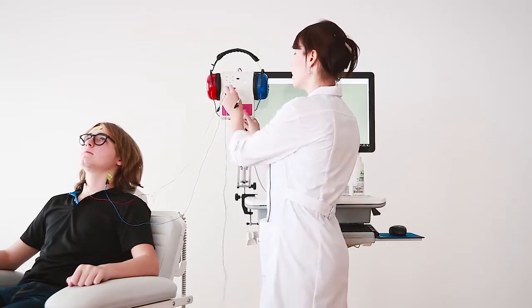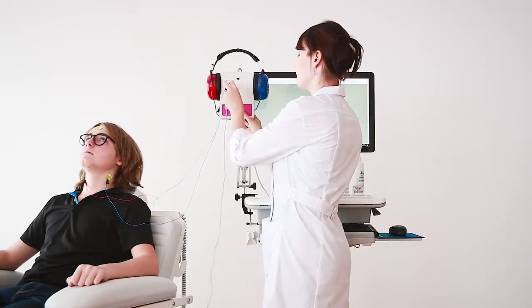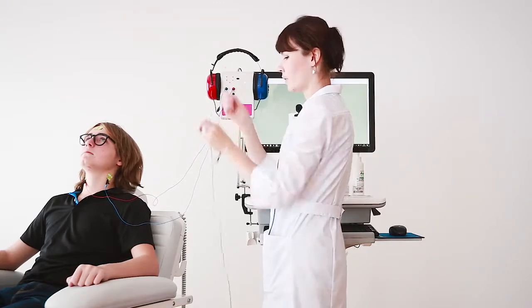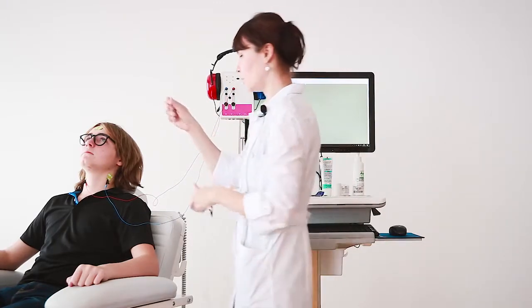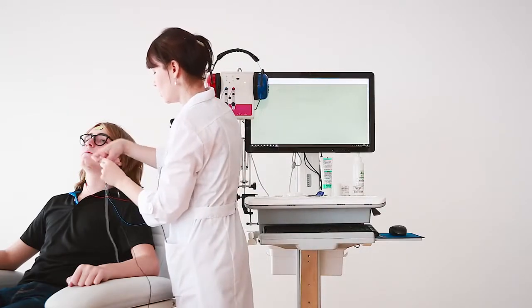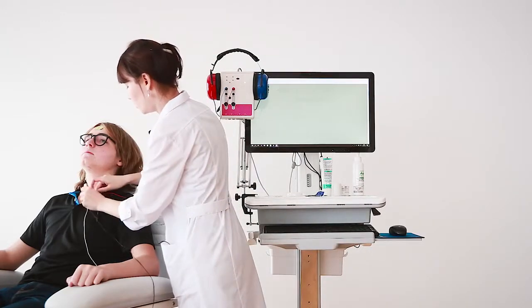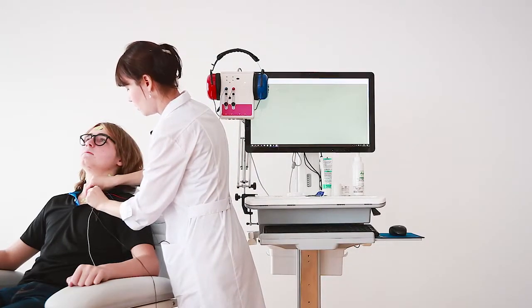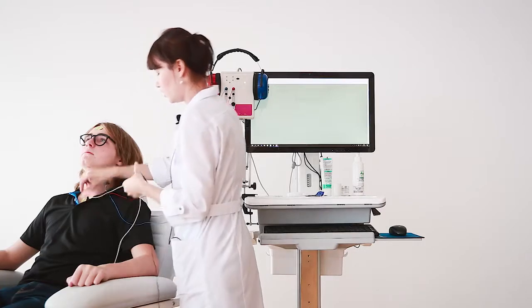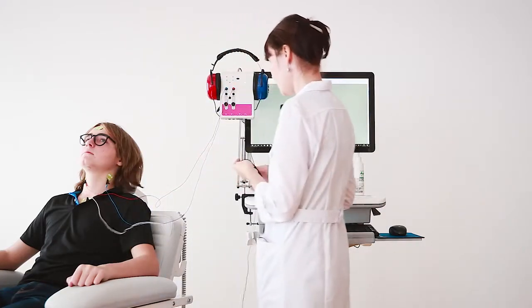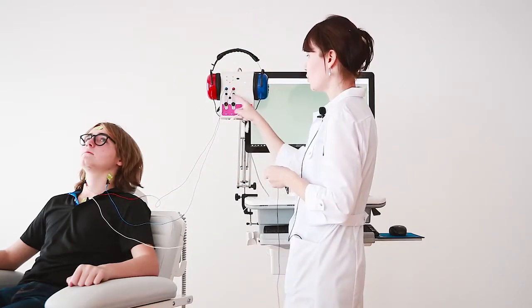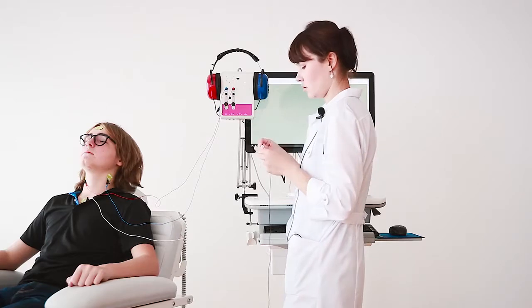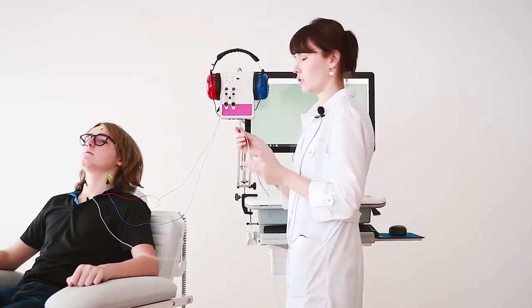As you can see, we have only one reference electrode situated on the clavicular. To spread the signal from this electrode to our plus channels, we use a special combiner.